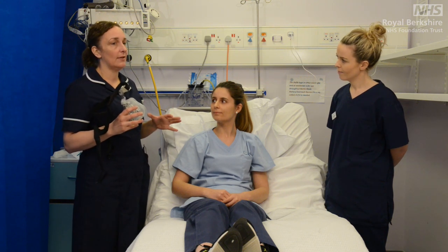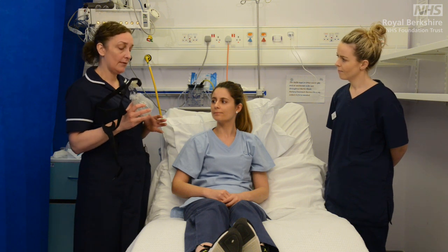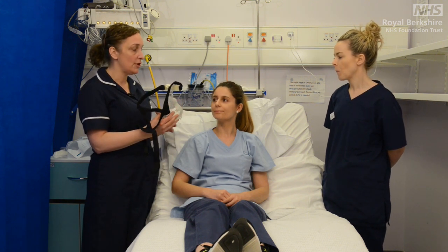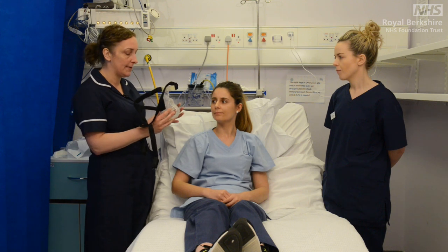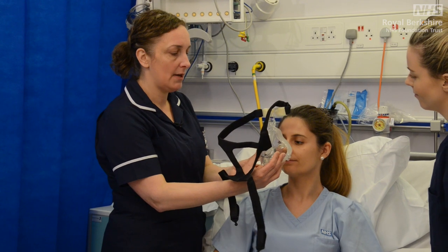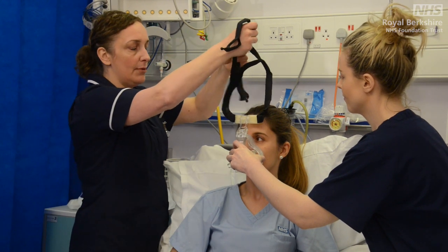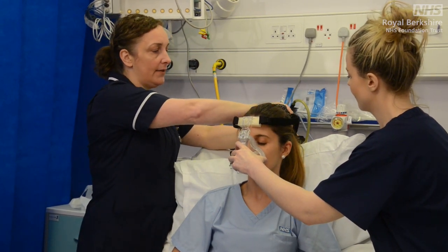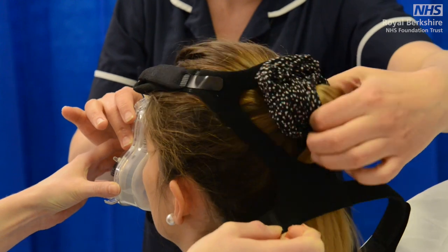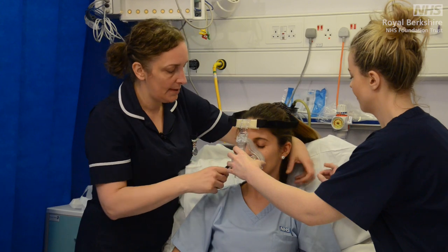Please explain to your patient what you are doing in depth before you do it. Remember, your patients are going to be really struggling for air — they will feel like they are suffocating. So you introducing plastic to cover their face is going to be the last thing that they want. You need to talk to your patient and explain what you're doing. Kerry, if you could just hold that mask up to the patient's face like so. It is then as simple as popping the harness over the patient's head. If the patient has long hair, you can pop the ponytail through the harness and then loosely bring around your straps.